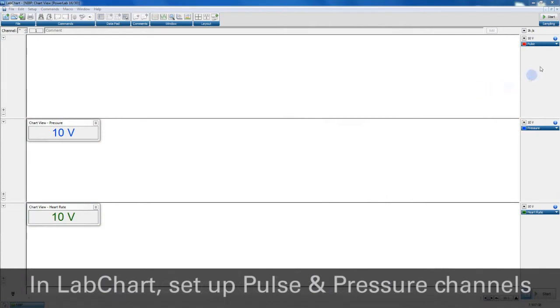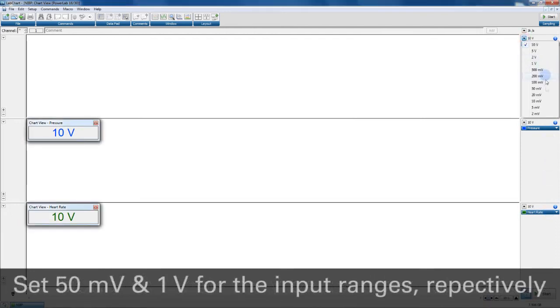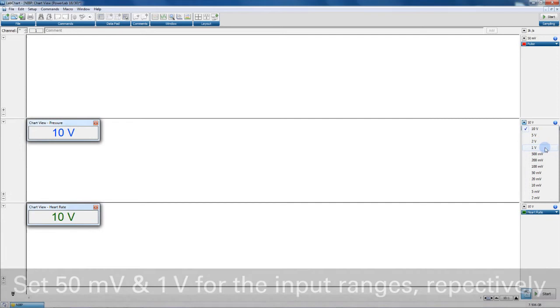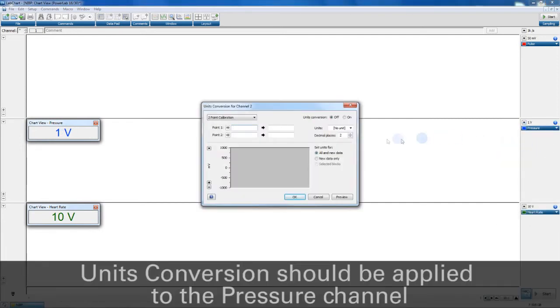In LabChart, set up two channels — one for the pulse signal and the other for pressure. You may also like to use cyclic measurements in a third channel to calculate heart rate from the pulse signal. The pulse channel range should be set to 50mV and the pressure channel range should be set to 1V. Units conversion should be applied to give 0V equal to 0 mmHg and 1V equal to 300 mmHg.